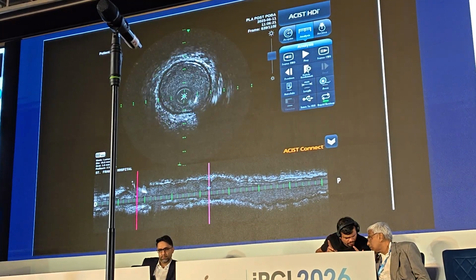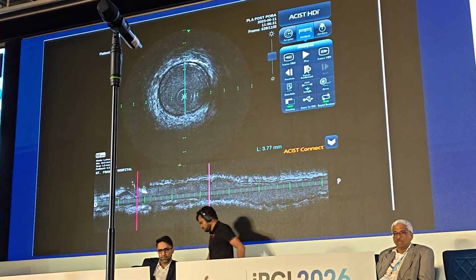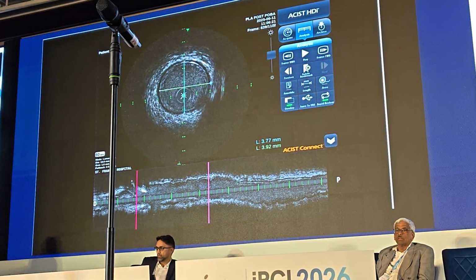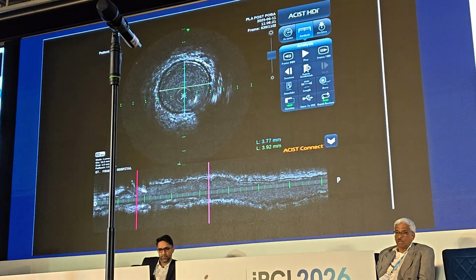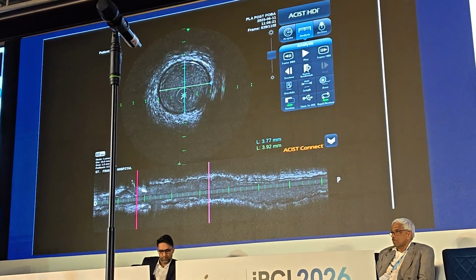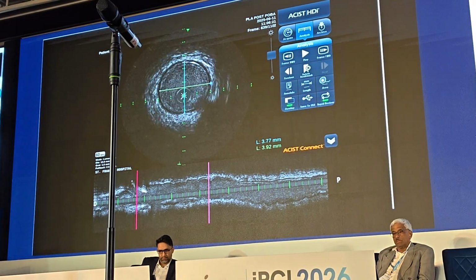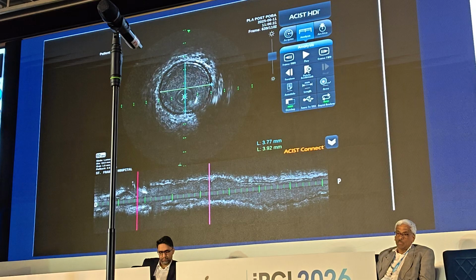And you know, one thing about the ostium of the side branch you saw: there's no diseased ostium, and that's very important because we're stenting across. That's why we went with a provisional strategy. We felt very likely that there wasn't going to be significant plaque shift, and the side branch would stay open at the ostium. So we made the measurements distally of how big the artery is, and the measurement proximally.